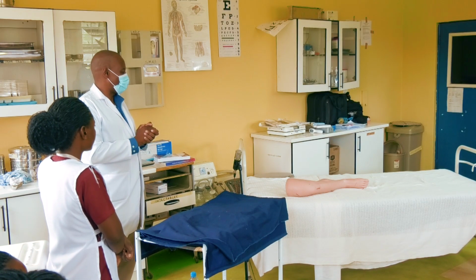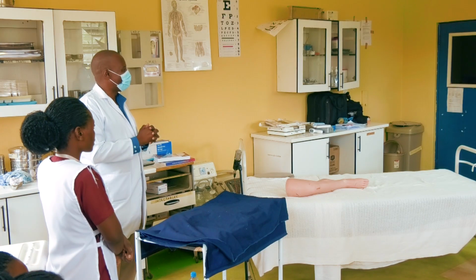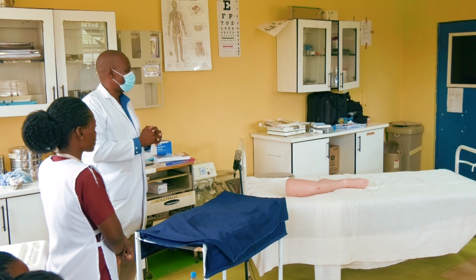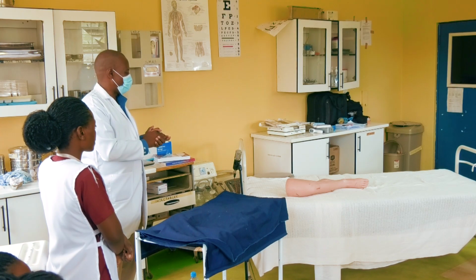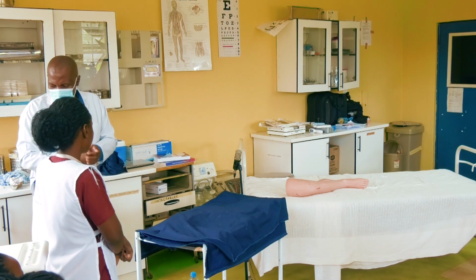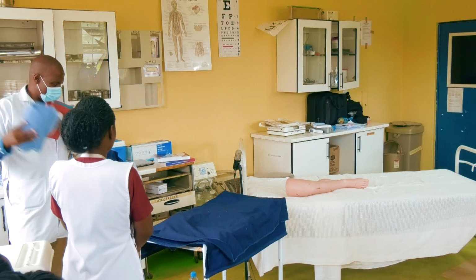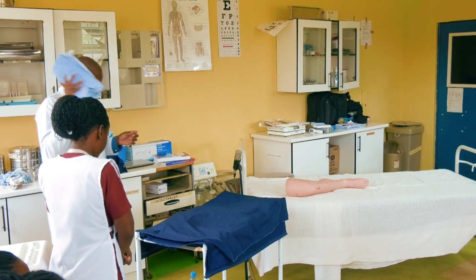I'm sure the procedure for the patient we know. Do we need to go through that? Yeah, we go to the patient, get permission, talk to the patient. Whatever you need to talk to the patient about, talk to them. There's something that I think we forgot. You need to have this, right?